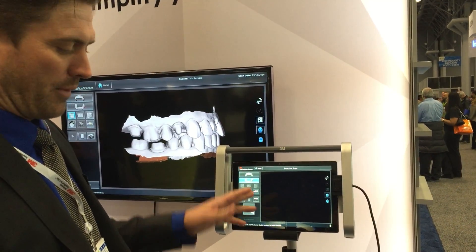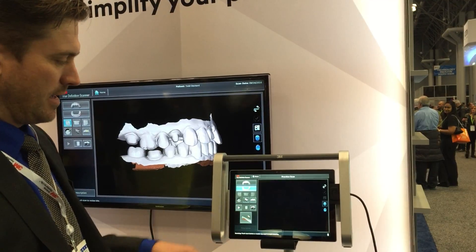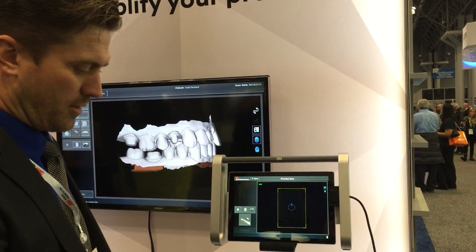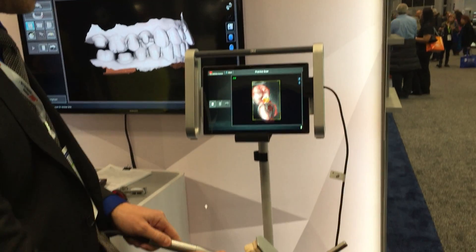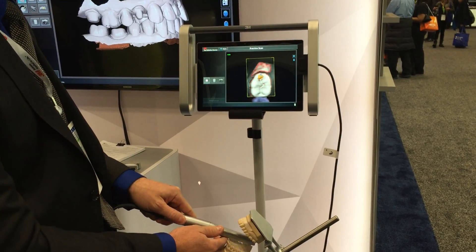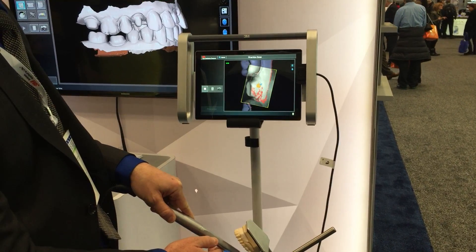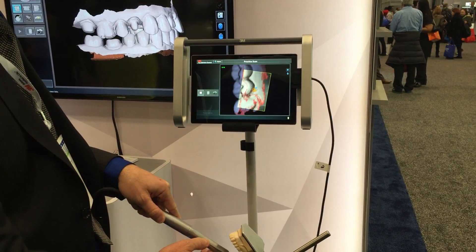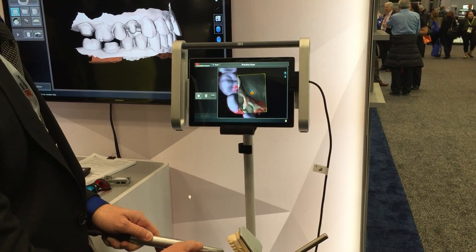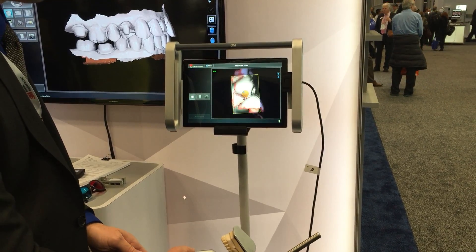We're gonna start and all you have to do is just pick it up, pick your arch, max out of the mandible, push play. When you begin to scan, put this close to the teeth and once it turns white you're good to go. You can go pretty rapidly with the scanner as you move around and it doesn't take very long. If you miss something, you go back to where you were and it picks it back up.